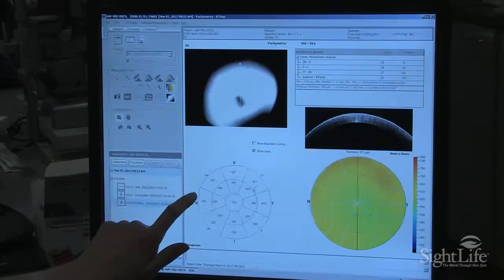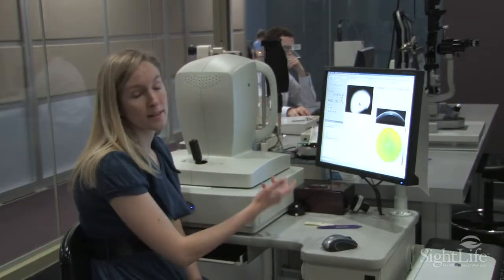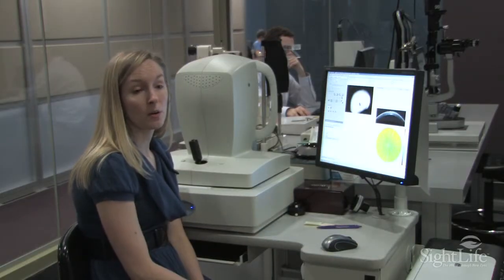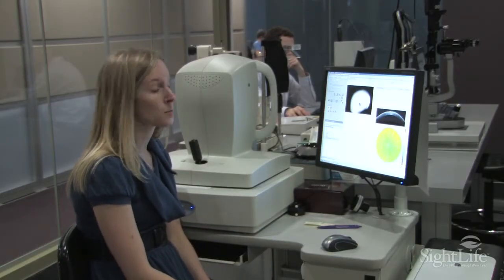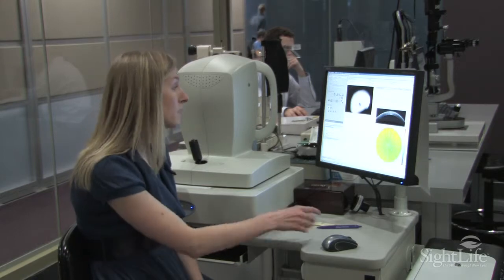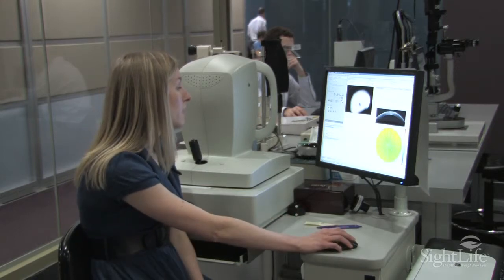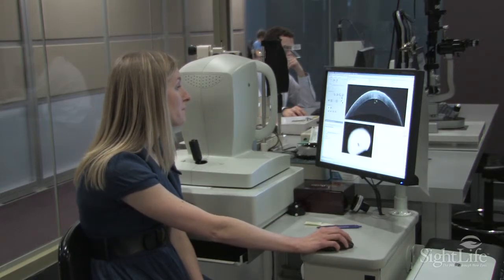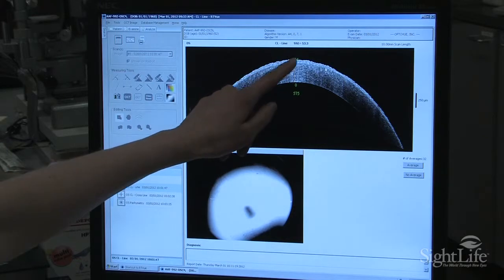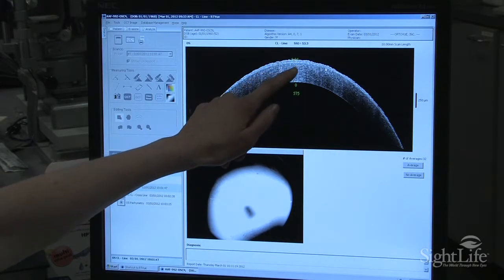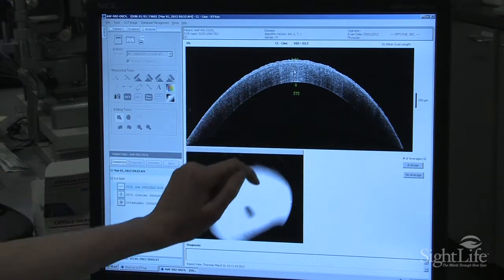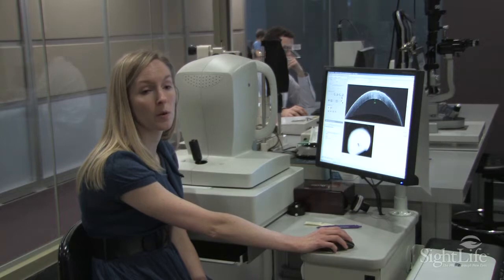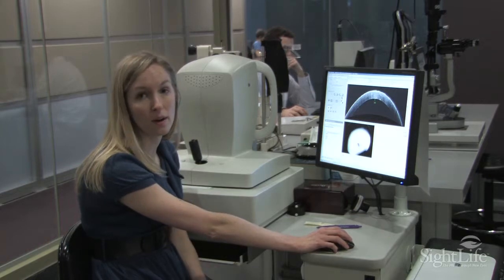It's really helpful for us — say we're slit lamping and there's a scar, and we can't really tell how thick it is. We can put it in here, and you'll see it would be kind of whitish around here, and then we can measure exactly how far that scar goes into the cornea so we can know what we could use it for.